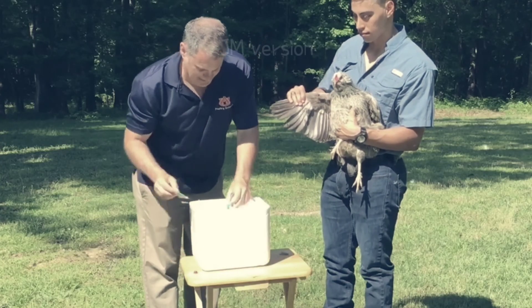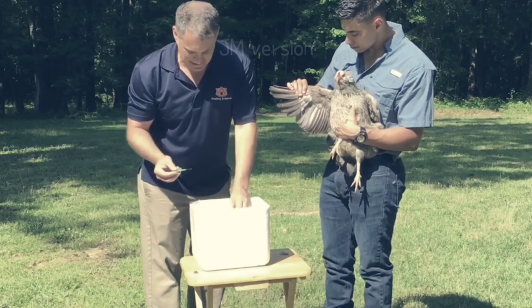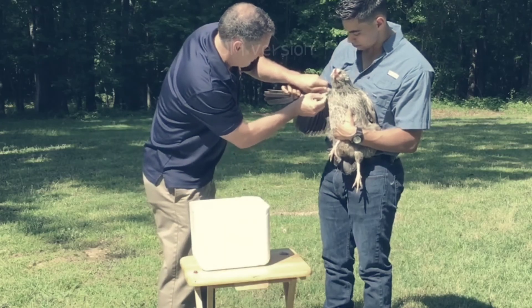Collect all of the chickens for vaccination ahead of time and have someone with you who can catch and hold the chickens while you do the wing web vaccination. Vaccinate the same wing on each bird to keep it consistent.